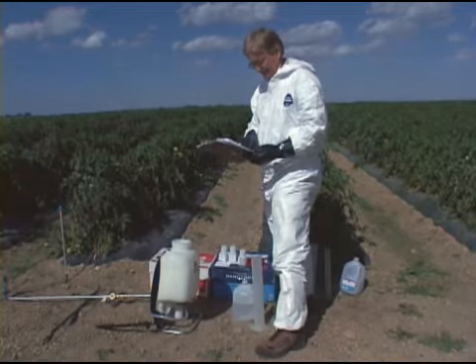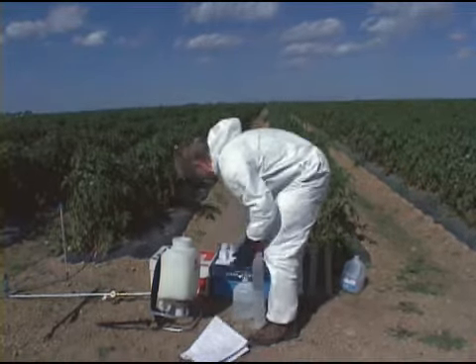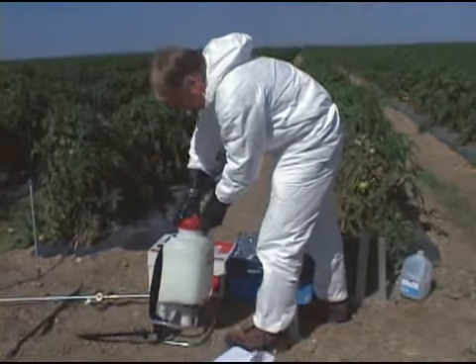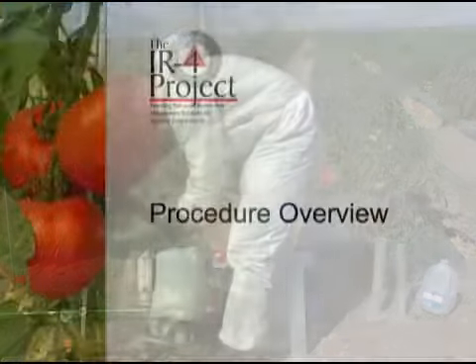Planning is important, and it's good to plan a few weeks in advance to avoid errors. However, sometimes errors do happen. If an error happens, contact the study director, Michael Braverman, as soon as possible.